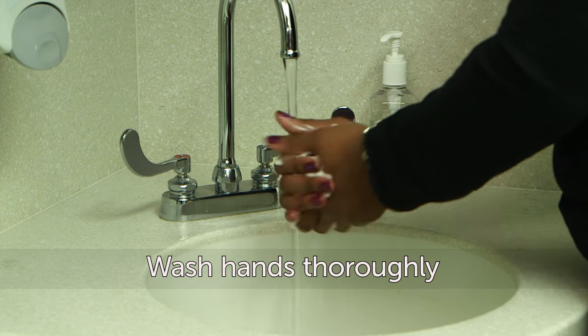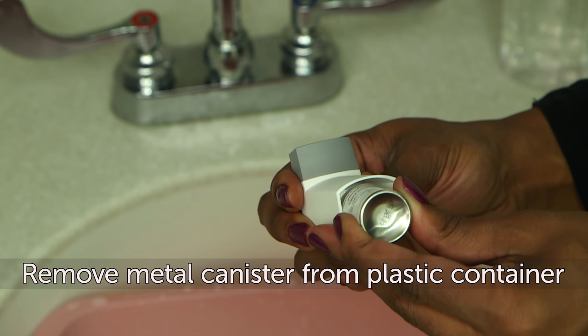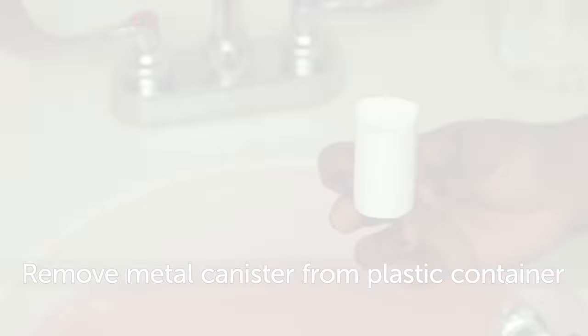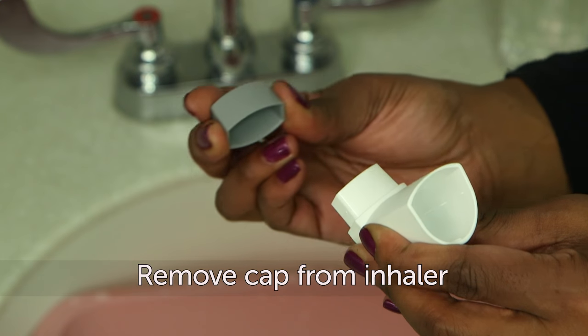First, wash your hands thoroughly. Next, take the metal canister out of the plastic container. Do not clean the metal canister or get it wet. Remove the cap from the inhaler.